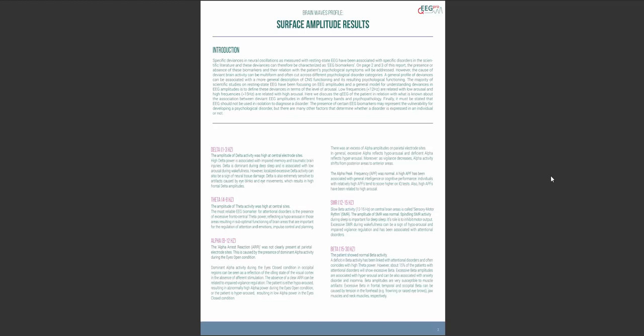The next page starts with a general introductory text about what to expect from this report. Below the introduction you can see the five classic frequency bands: Delta, theta, alpha, SMR and beta. Let's start with delta.